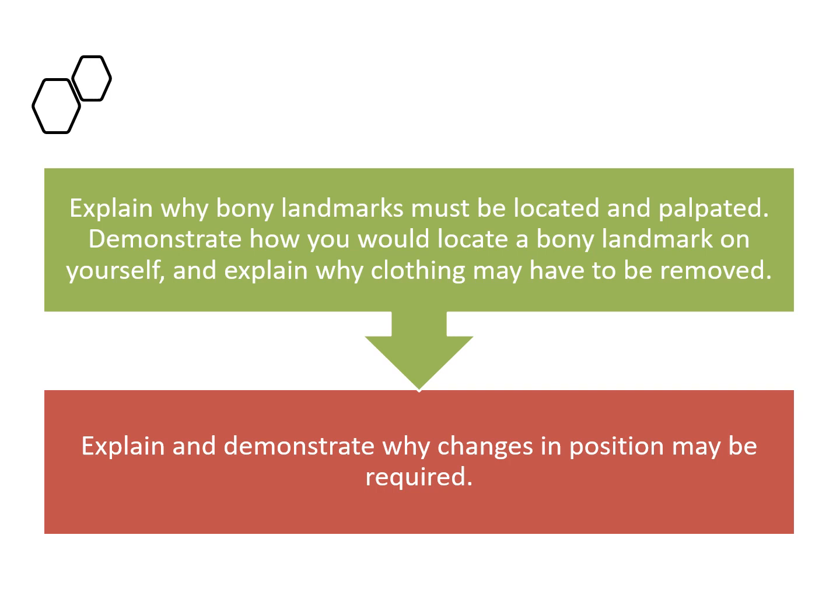So you need to explain why it is so necessary to expose the particular landmark, because you have to place the axis of the goniometer and your correct readings depend on the patient's cooperation and the landmarks exposed. So that is why you have to explain this process to the patient very well.